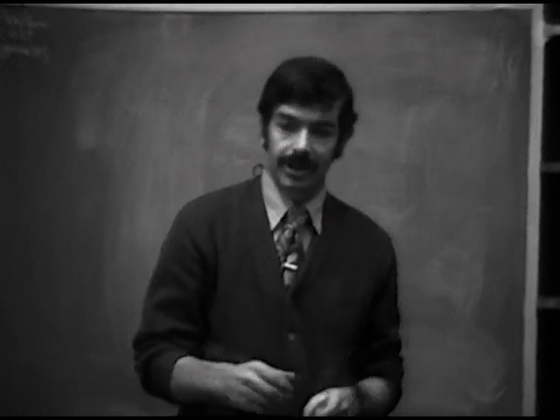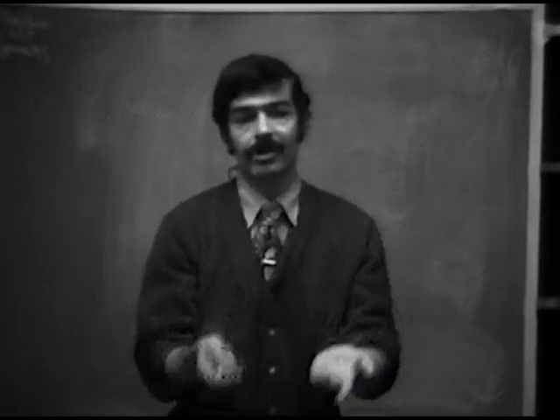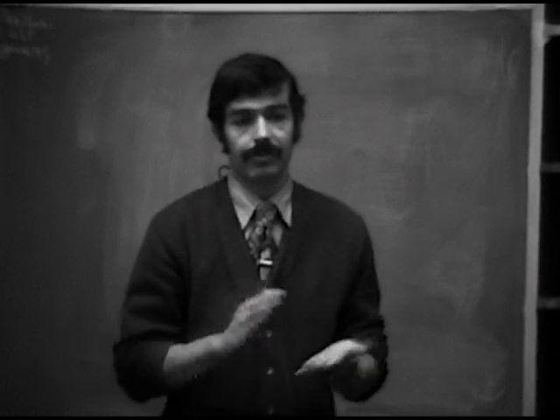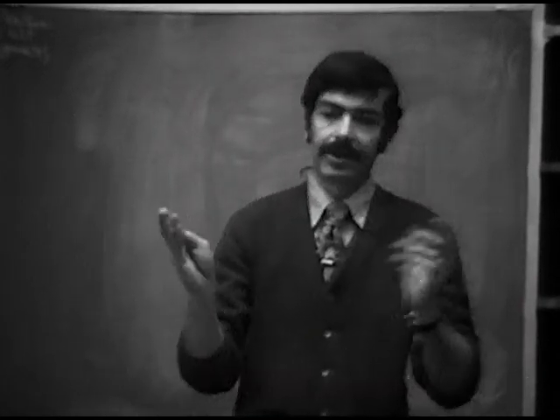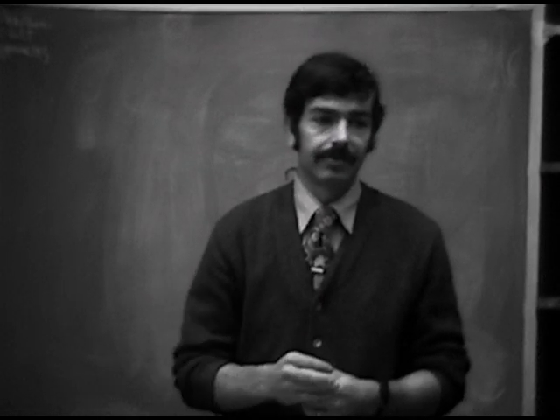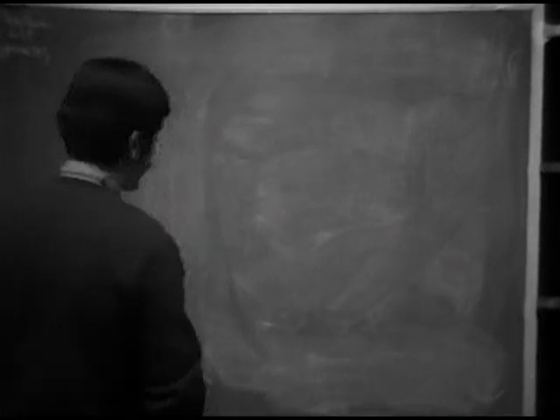Whereas if they would just take the time and go through a routine that we're going to describe, things would automatically just pop out at them, and they would have a diagnosis. Also, other people have a tendency, they see an inferior MI, and then they throw the tracing away, and they forget about noticing the first-degree block and other things, which can be extremely important. So I think for many reasons, it's important that we develop a routine.